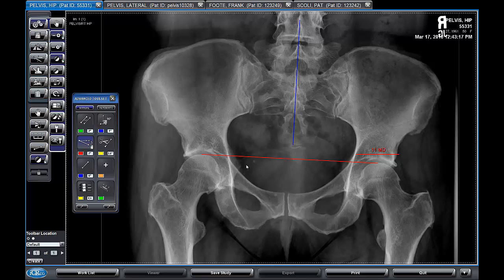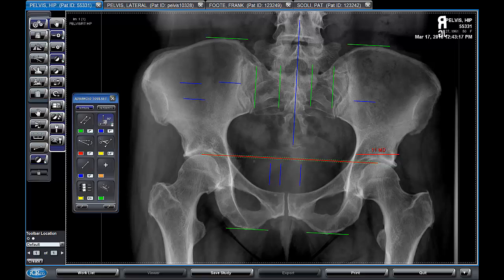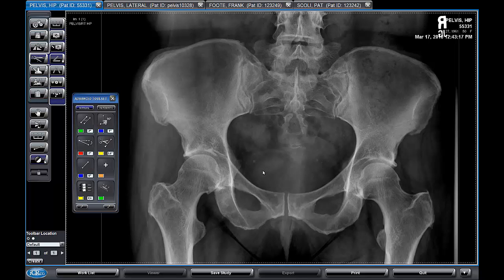Once we have lines, we want a way to easily create parallel and perpendicular lines to our existing lines. With the parallel line tool, we choose the line we want as a reference, and then with a single click we can drop several lines parallel to our reference line. If we click to change our reference line, the parallel lines will reflect that. We can do the same with perpendicular lines. You can create parallel and perpendicular lines from any annotation composed of lines — so if we have an angle and want a line parallel to one of the segments, we can just choose the segment and drop some parallel lines.